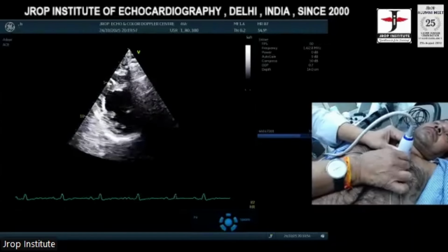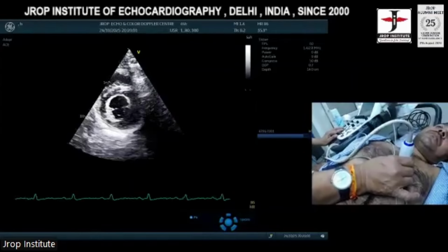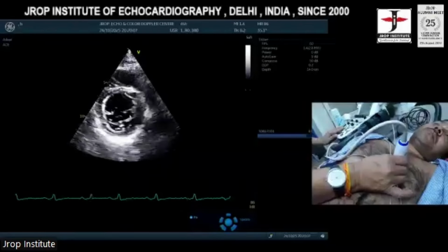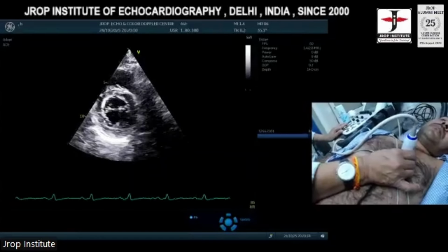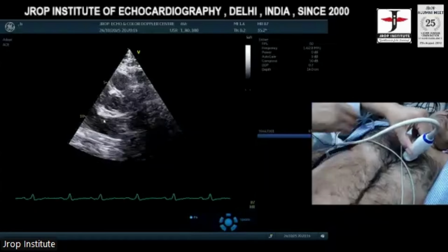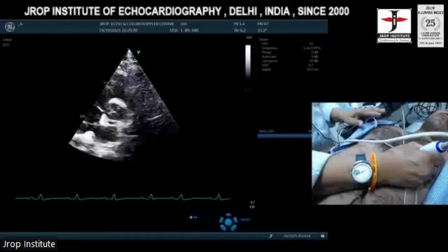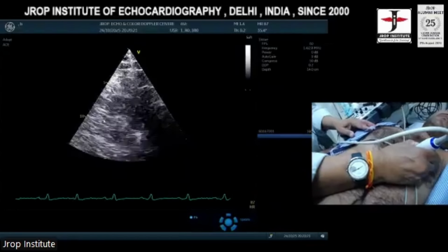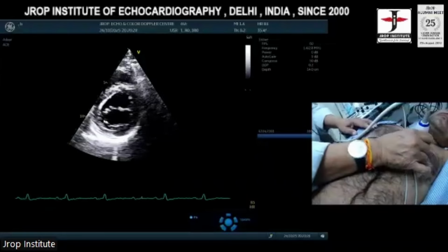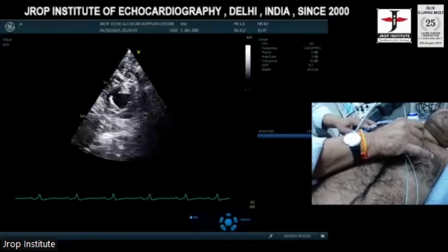And what do we see in the mitral valve? We see AML, PML, lateral commissure, medial commissure. Now for the mitral valve, my footprint is looking towards the aorta. So here is the aorta. In the parasternal short axis view, the aorta will come automatically. Now I'm going back: mitral valve, then towards the left hip, and finally the apex.